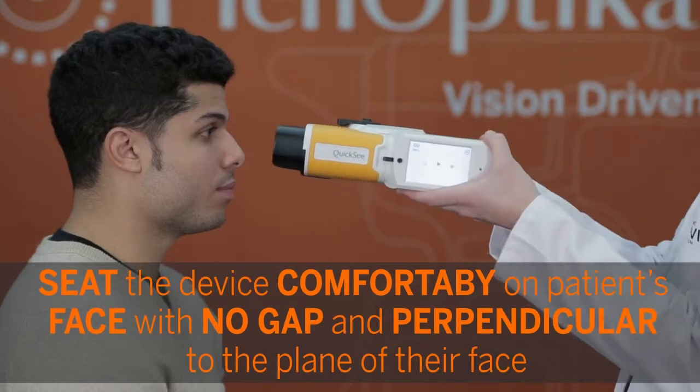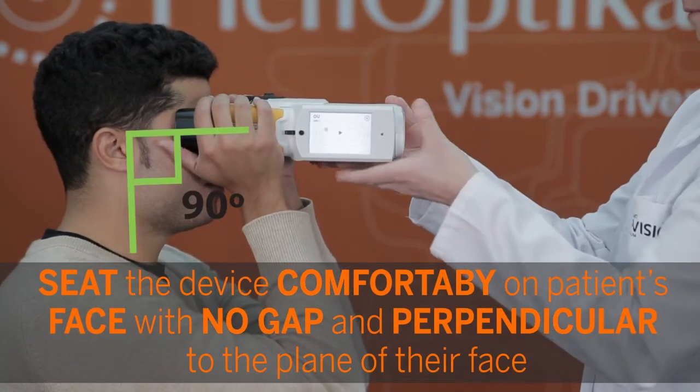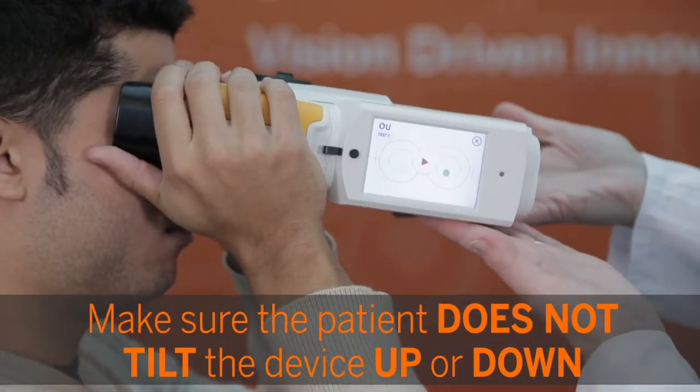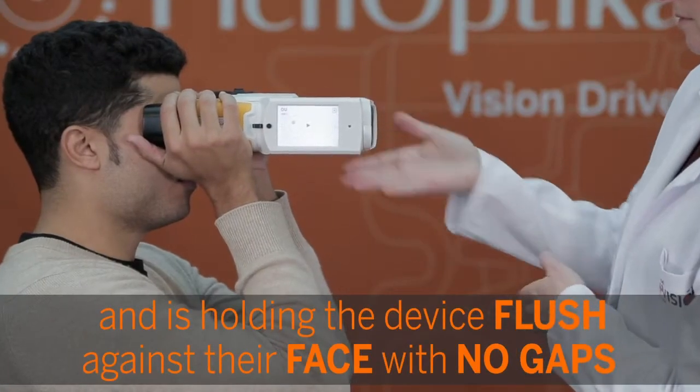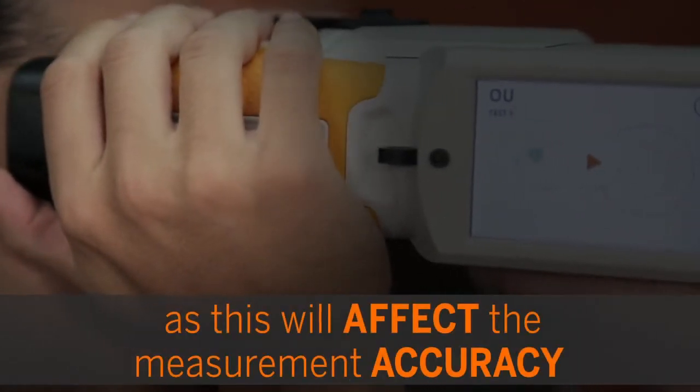Seat the device comfortably on the patient's face with no gap and perpendicular to the plane of their face. Make sure the patient does not tilt the device up or down and is holding the device flush against their face with no gaps, as this will affect the measurement accuracy.